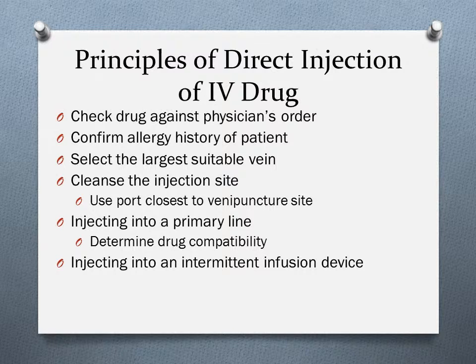Remember that the drug is immediately diluted with blood, so this will minimize the irritation of the vein wall and decreases the likelihood of venous spasms. Always cleanse the injection site with antiseptic for at least 30 seconds. You'll cleanse the skin if you still need to perform a venipuncture, or the Y injection port of a primary IV administration set, or the injection port of an intermittent infusion device.